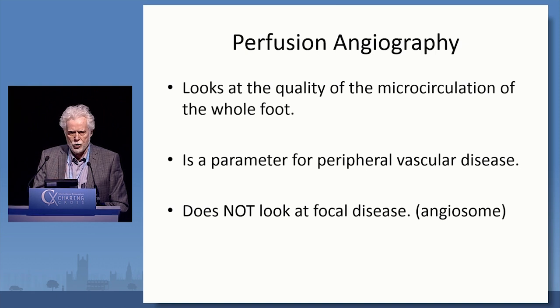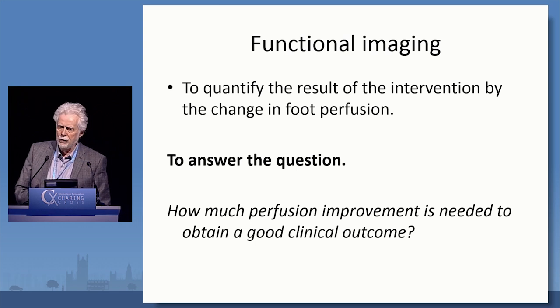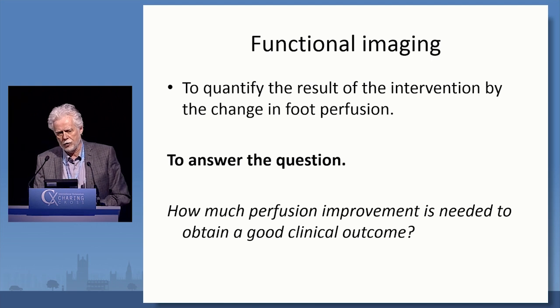It doesn't focus on a specific place. It's a 2D technique. It's a summation of the disease in the whole foot. And what we do, and I'm a radiologist, and we are used to doing things we call functional imaging. We do it in the brain, and we do it in other areas. And this is actually what we're doing: also functional imaging, to look at the quality, to quantify the result of our intervention by the change in perfusion. And that is functional imaging.